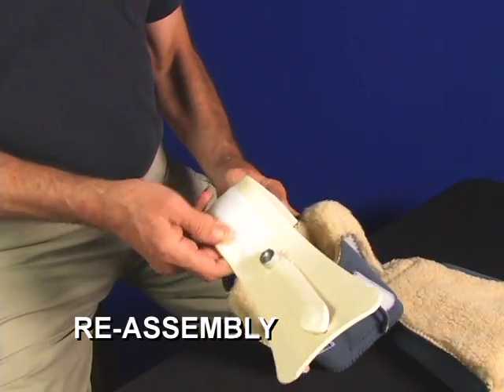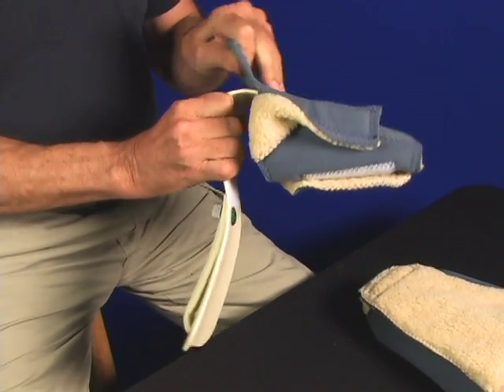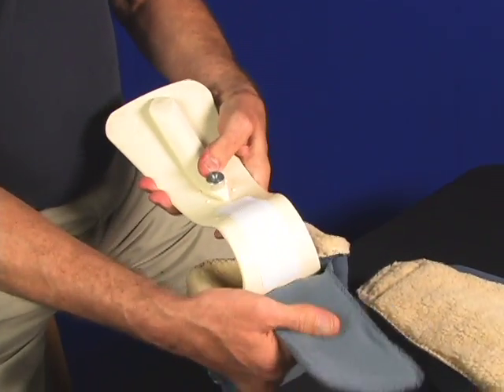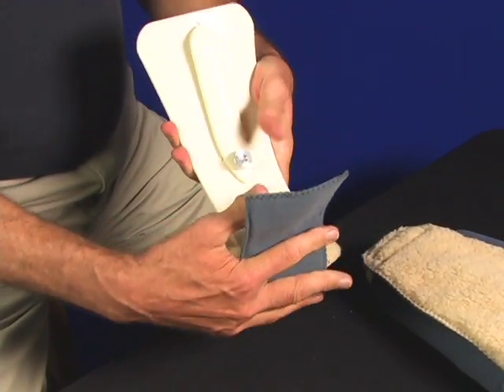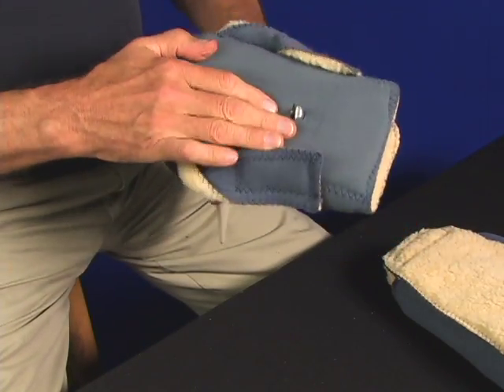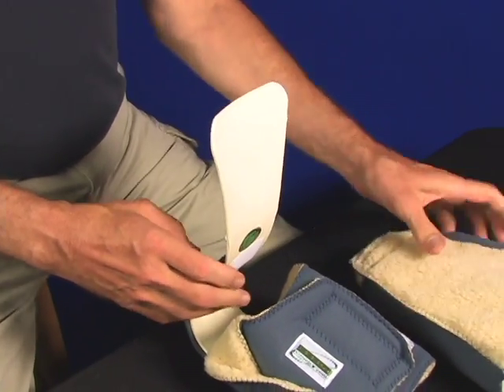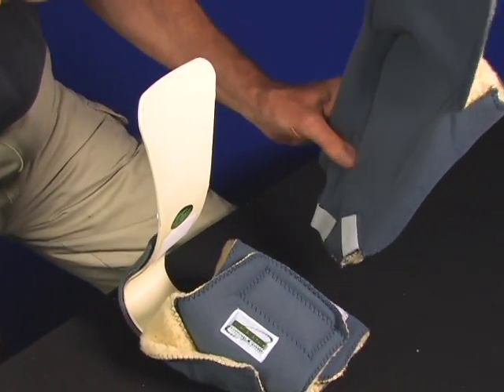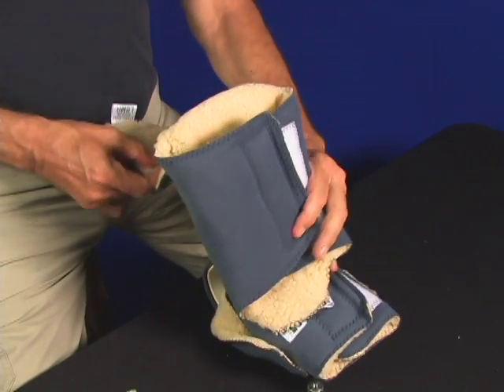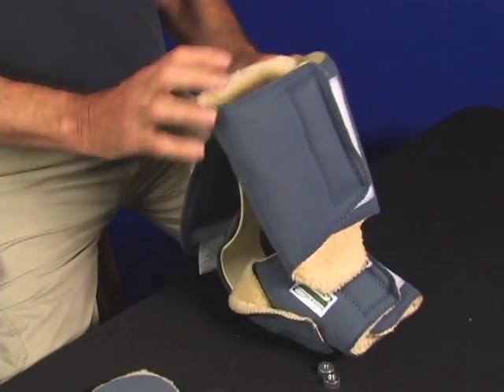To reassemble, start with the bottom cover first. Insert the shell into the bottom cover, watching out for the bolts as you slide the cover on. Lift up the fabric tongue that wraps around the back of the Kydex, engage that fabric tongue to the back of the Kydex, and check the bolts. Now turn the boot upright to put on the top cover — first engage the slot at the top of the cover that is sewn in place to accept the top of the boot shell.